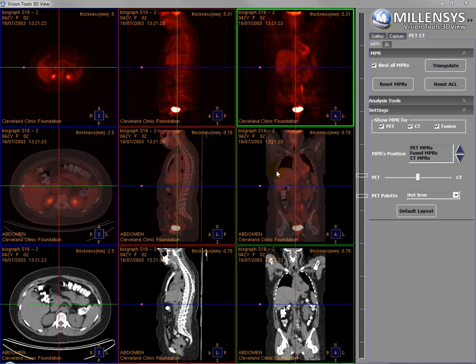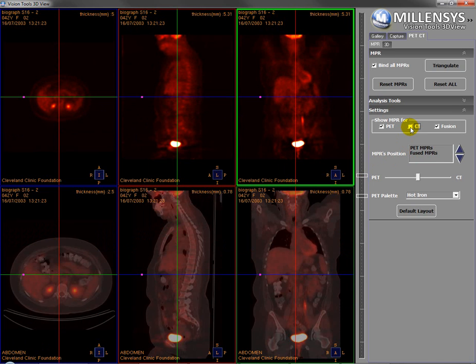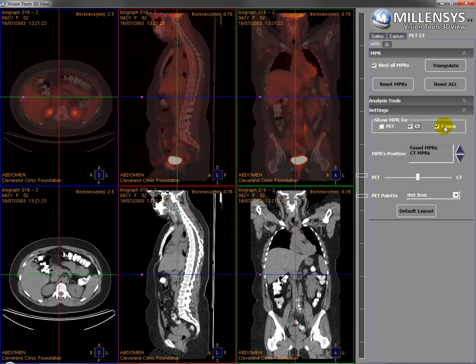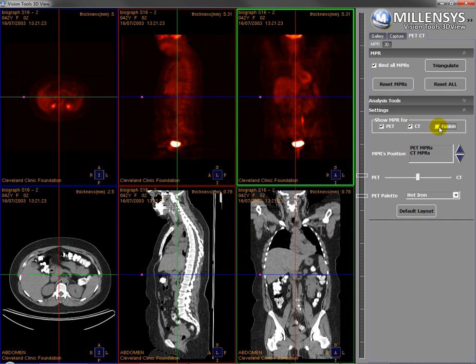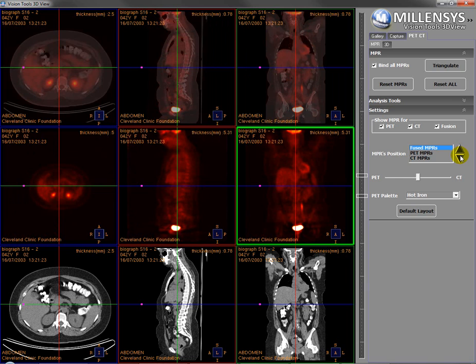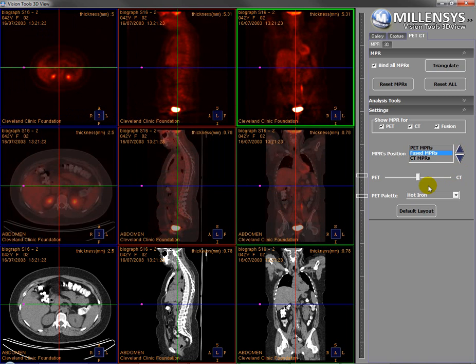I can control this layout here. For example, I can hide the CT, I can hide the PET, I can keep the CT and the fusion, or I can keep the CT and the PET, and so forth. I can also control the positions of these views — suppose I like the fused view at the upper portion of the screen or the middle. I can also control the amount of fusion between the CT and the PET.